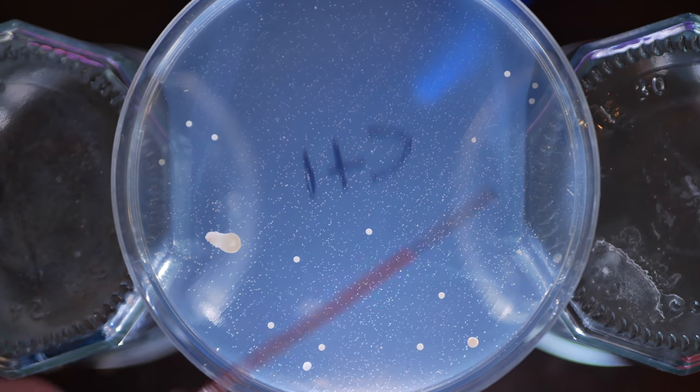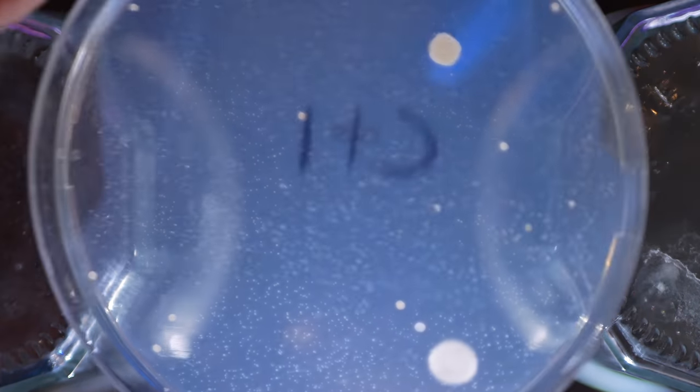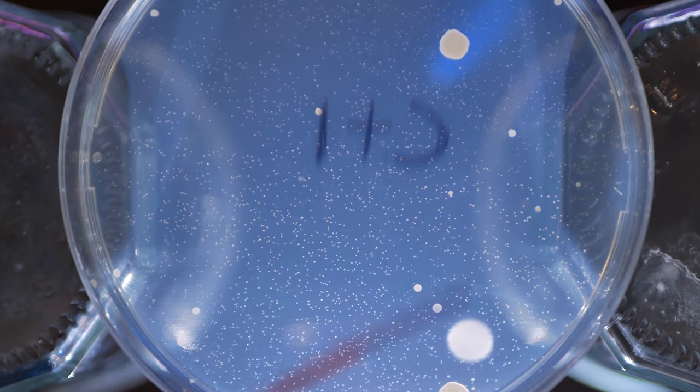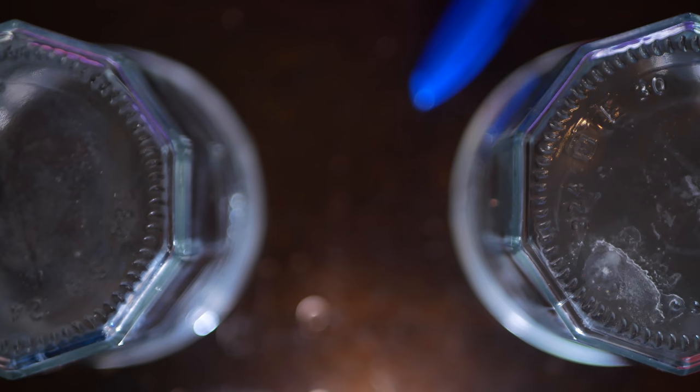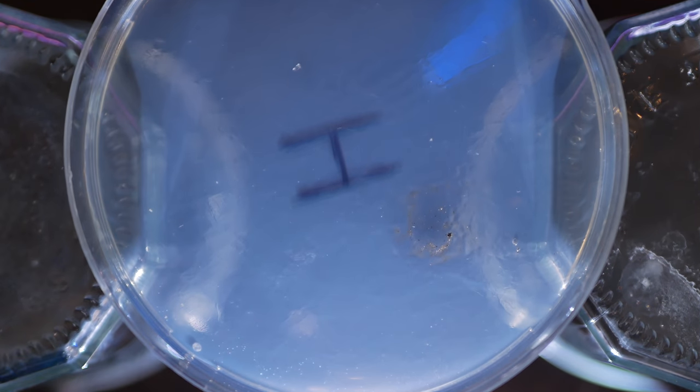There's bacterial growth evenly across the entire plate, couple larger colonies popping up, but the whole thing's been inoculated. Same story for the second control plate and the third control plate, though it's got some pretty large growth colonies there. Moving over to the hot plasma, yeah, totally different story here.